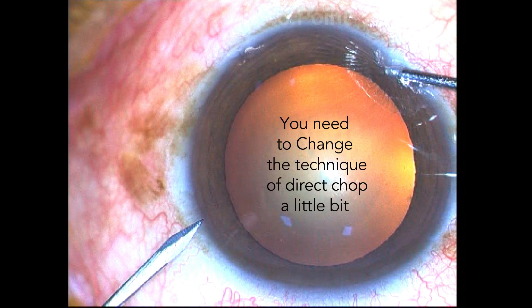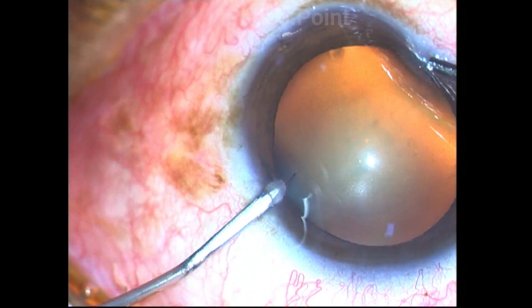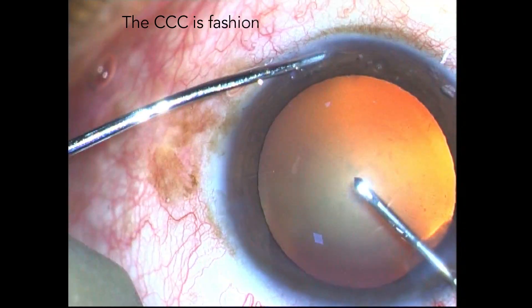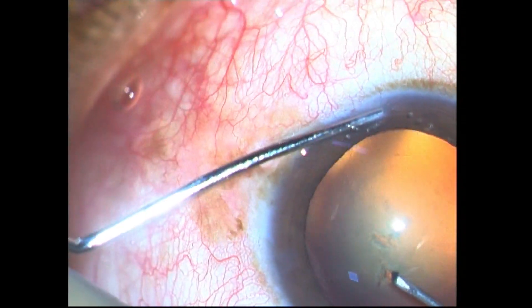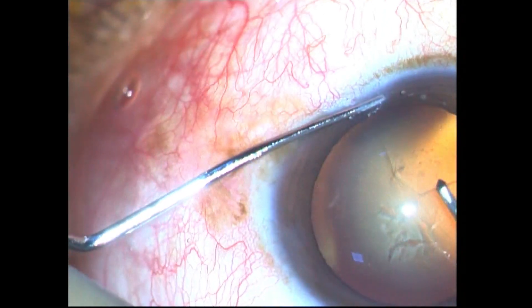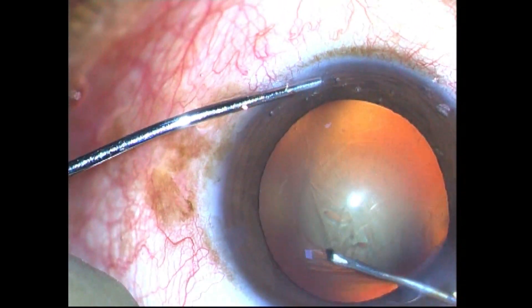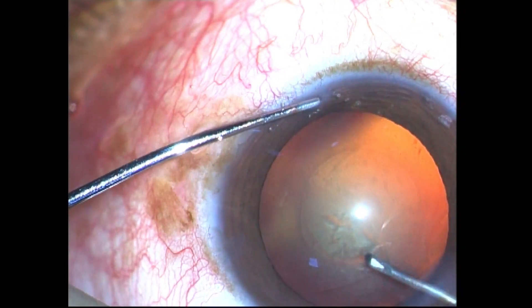The important message is we need to change the direct chop technique a bit in these cases. While performing capsular rhexis, I try to use the edge of the nucleus sclerosis area as a template on which to fashion my capsulorrhexis, resulting in a nice round central 4.5 to 5 millimeter curvilinear capsular rhexis.